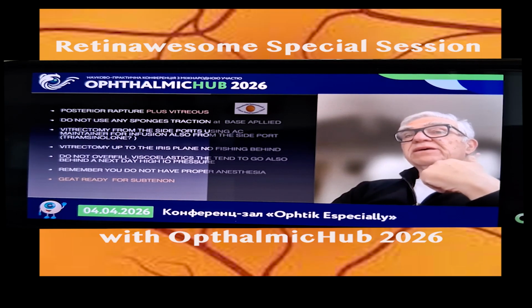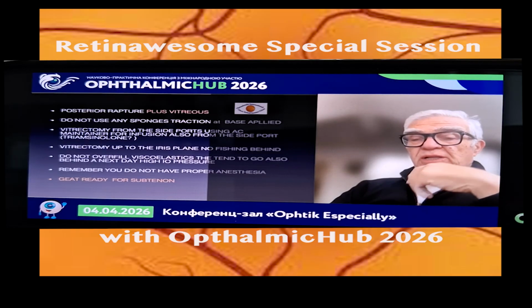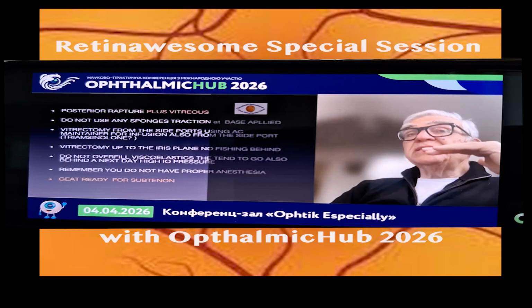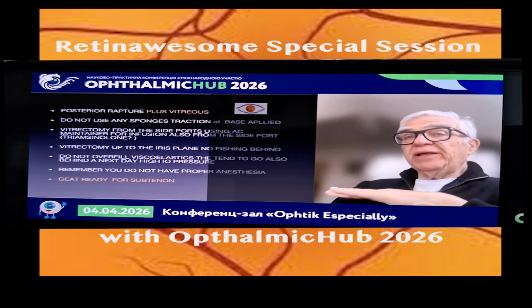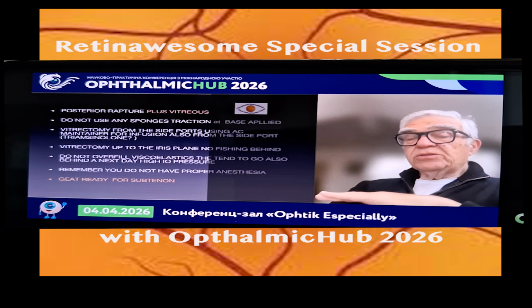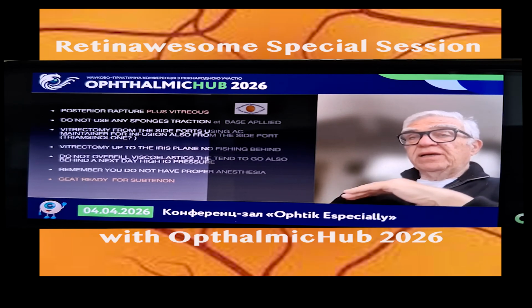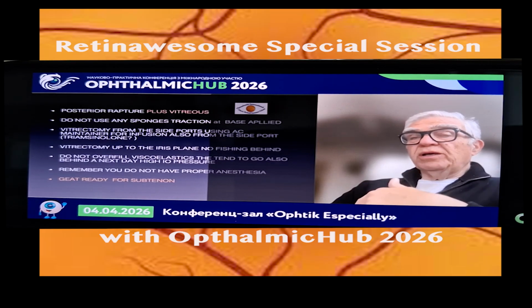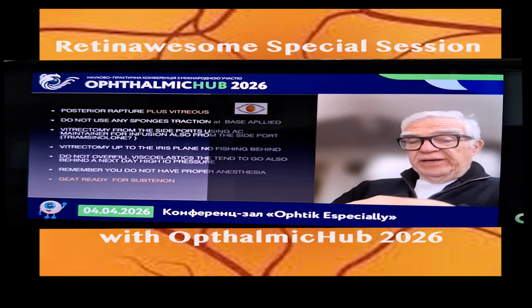The second thing is how to remove this vitreous. You do vitrectomy from side ports, but you need to reach the posterior plane of the iris, the anterior plane of the iris. Do not go blindly behind the pupillary, because this way you attract more and more vitreous to come to the front of the eye.